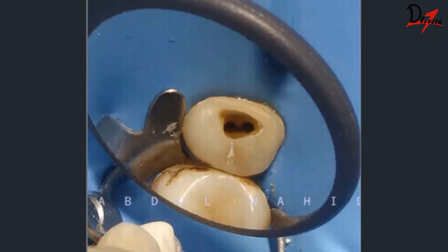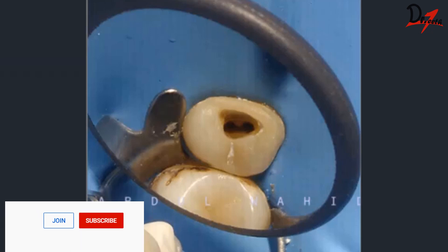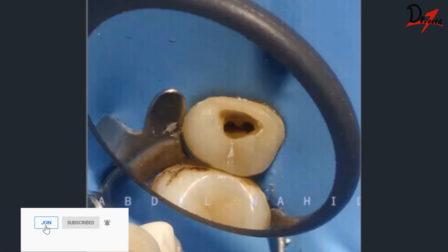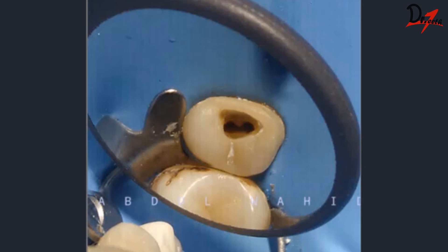We then took a working length radiograph with a file inside the canal. Once the working length was established, we prepared both canals, followed by thorough irrigation — which we will discuss in detail in upcoming videos. For now, the canals were cleaned and irrigated thoroughly, which was followed by obturation.